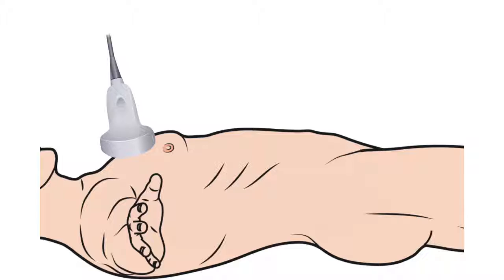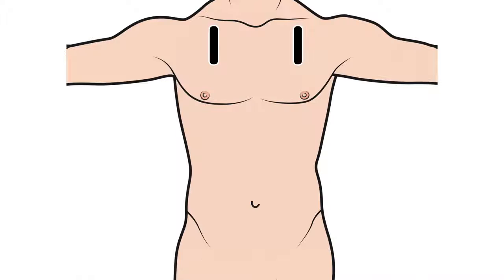Our next view is going to be the intercostal view, looking for the presence or absence of pneumothorax. We're looking in the mid-clavicular line at the second intercostal space, right where you would needle decompress, and we're looking for the presence or absence of pneumothorax. Now remember, we are looking for large pneumothoraces that would impact our care in the trauma bay and need immediate decompression or treatment, not necessarily small pneumothoraces that can be evaluated further.